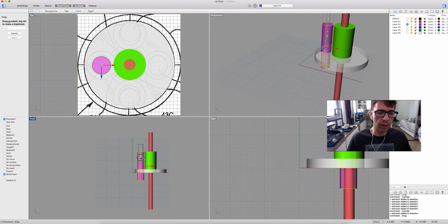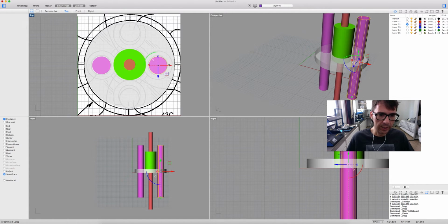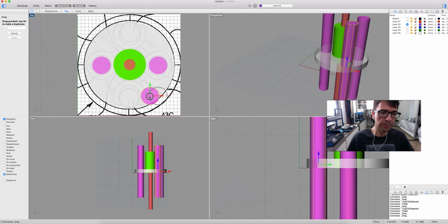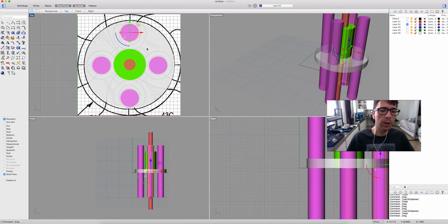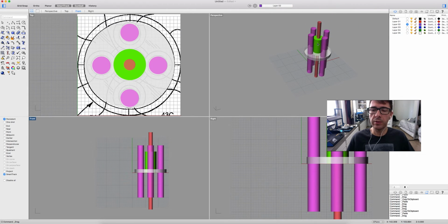I like to move the screws from the inner part to the outer part. And now we just click copy and paste and move to the other positions. Let's copy and paste. Copy and paste again. And now we already have our base plate with the central pin guide, with the peg and the screws.